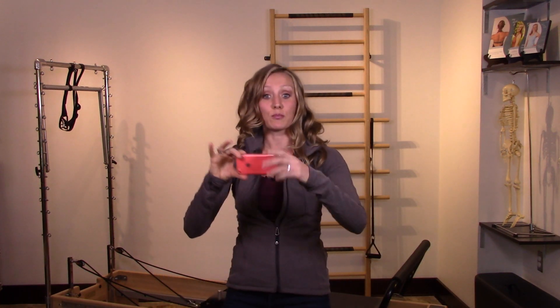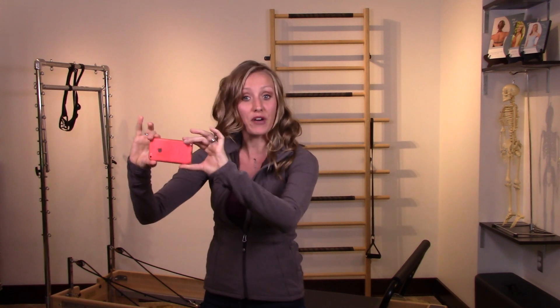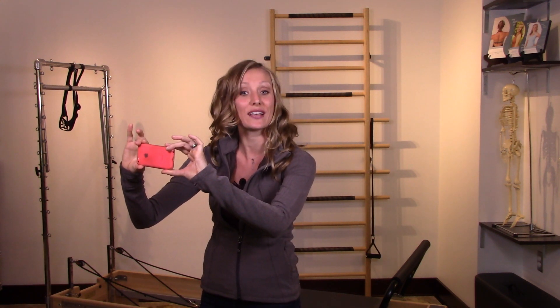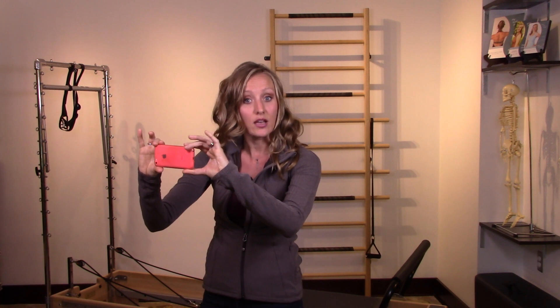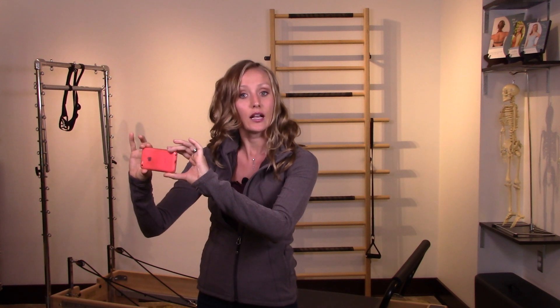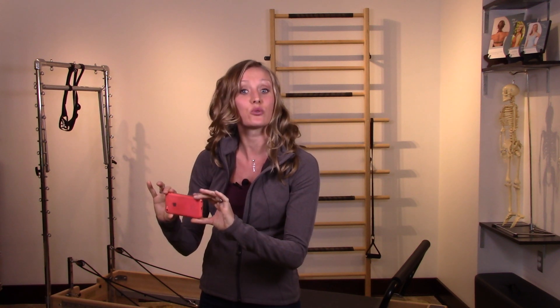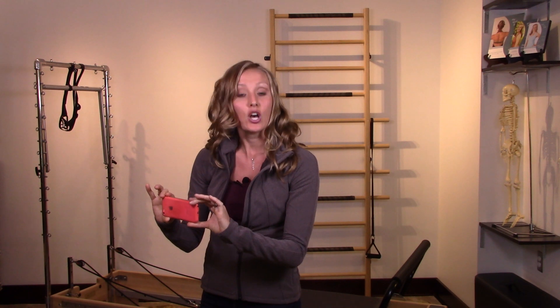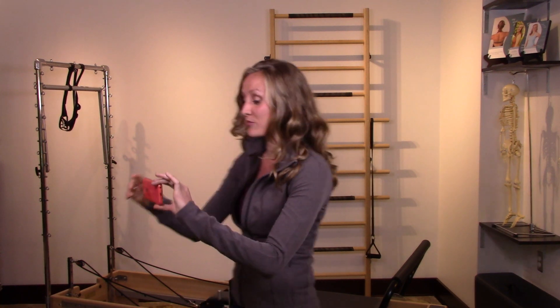Let me demonstrate how to use a scoliometer. Pull up the Scoliometer by Spiral Spine app on your phone. You're going to keep the phone at a perpendicular or right angle to the floor. Put your thumbs on either side of the phone. Anchor your thumbs and the phone to the base of the neck of the person who has scoliosis. The spine needs to stay in the middle of the phone, so the phone may have to move accordingly as it goes down the back. The person who has scoliosis is going to slowly round their back and reach their hands towards the floor. The phone will go down their back as they roll forward. Keep both right and left sides of the phone anchored on the back so the scoliometer can pick up the rotation of the spine. You'll notice the numbers on the scoliometer toggle as it goes down the spine — these are the rotational or scoliometer measurements of the scoliosis.